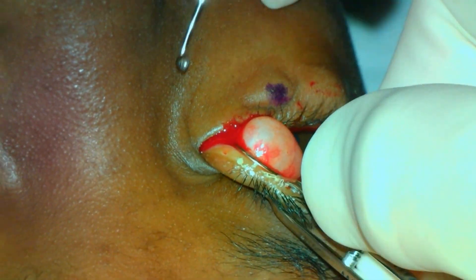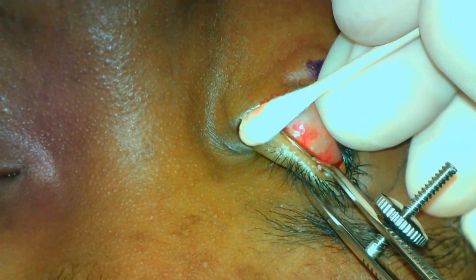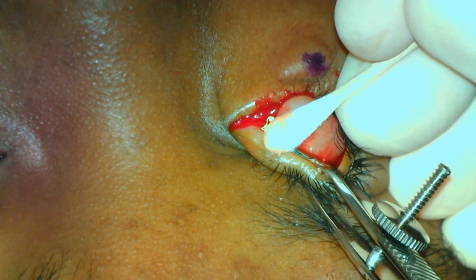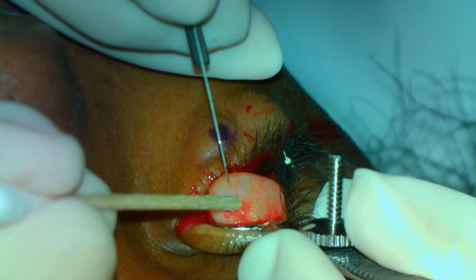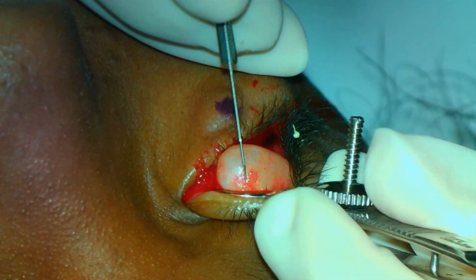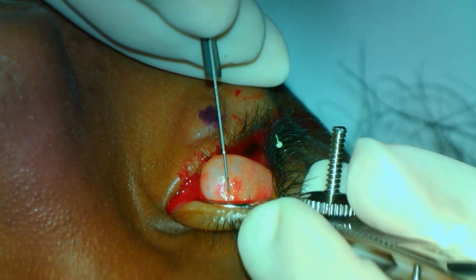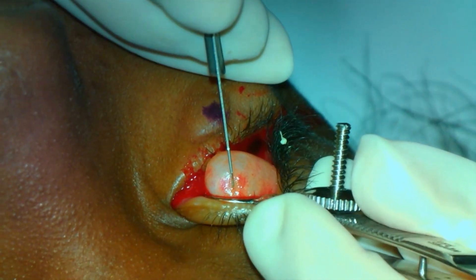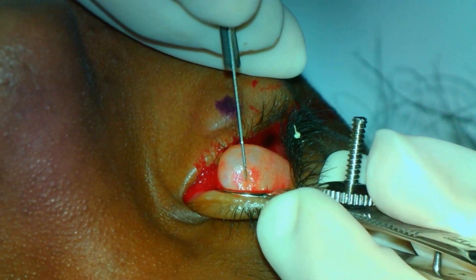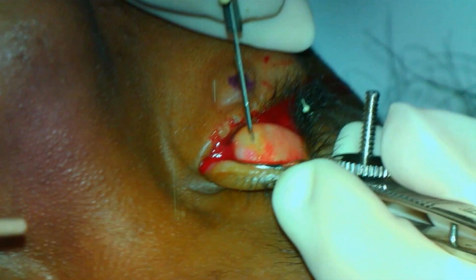The 11 blade will be used to make an incision through the conjunctiva in the area of the chalazion, which is now under significant pressure from the clamp. On incision of the lesion, the pressure of the contents is demonstrated. On review in slow motion, the pressure of the contents is better appreciated. Eye protection should be worn even when performing an incision and drainage of a chalazion.